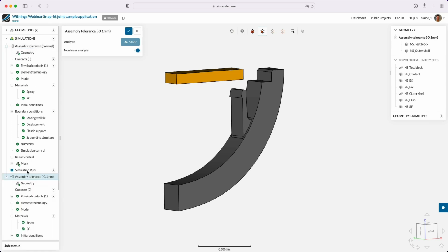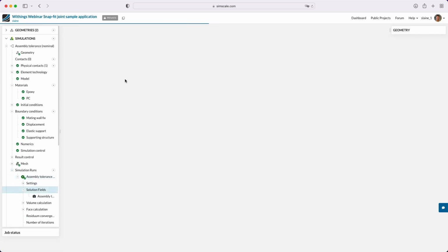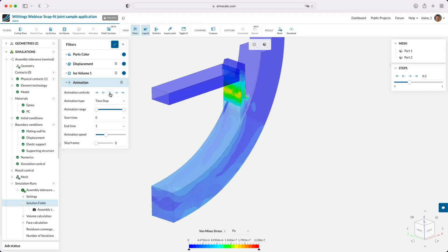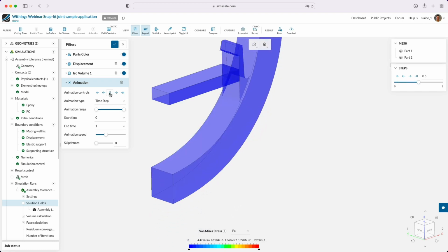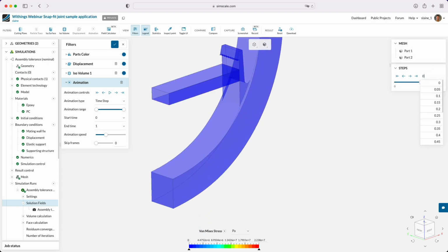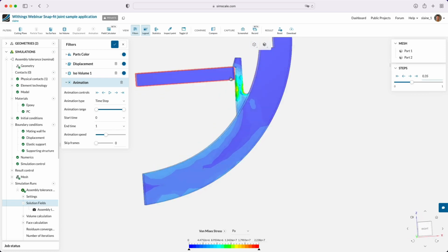So we've analysed this snap fit at the assembly tolerance, so with all of the parts at their drawing tolerance, the nominal tolerance, and also the assembly tolerance. So this is as it's designed to work. And we can see it's snapping together nicely here in the animation. So if we go to the peak stress point where the snap fit is just about to snap back over, we can have a look at the stresses that we've got here.